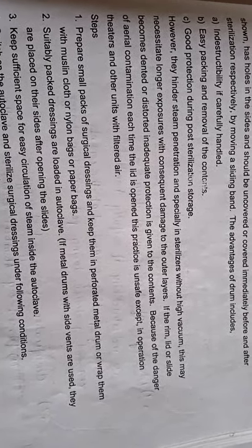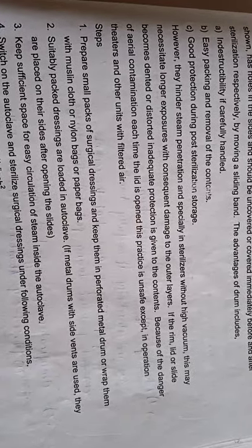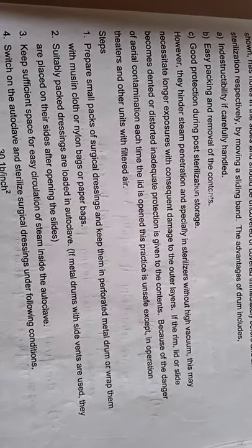The metal drum requires a longer sterilization time because we are not using a vacuum in the metal drum, so you will require more time to sterilize it. If the rim, lid, or slide becomes dented or distorted, inadequate protection is given to the contents — meaning if the slide, rim, or lid of the metal drum is damaged, we cannot provide protection to the contents.